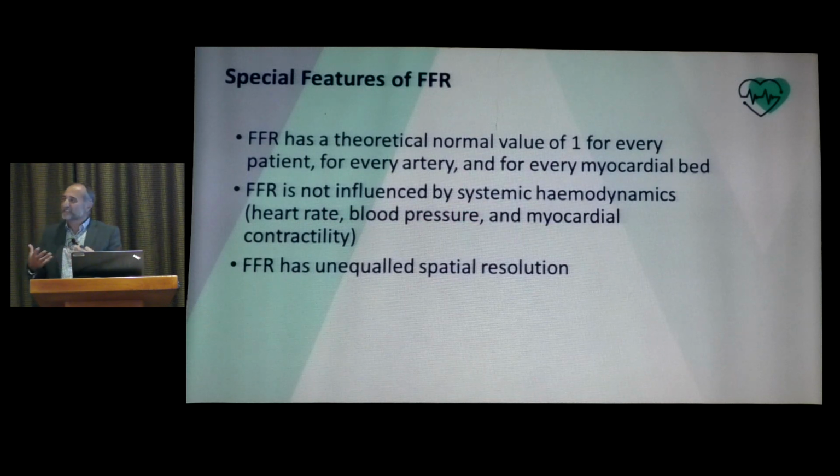FFR is not affected by hemodynamic changes, it's not affected by heart rate, blood pressure, and it's also not affected by myocardial contractility. So irrespective of the patient's heart rate, blood pressure, myocardial contractility, or state of the left ventricular function, you can still obtain an accurate FFR.